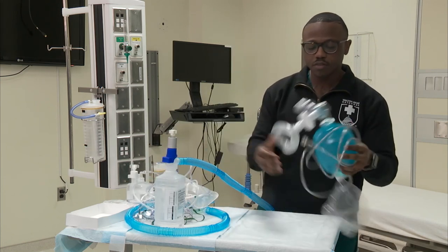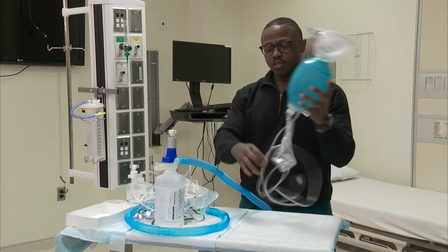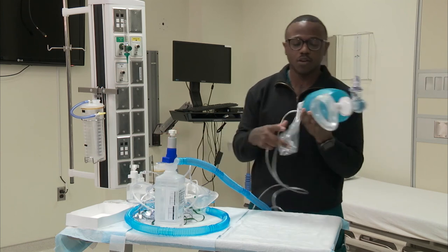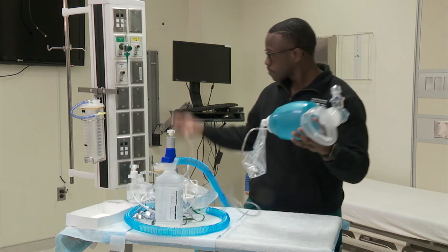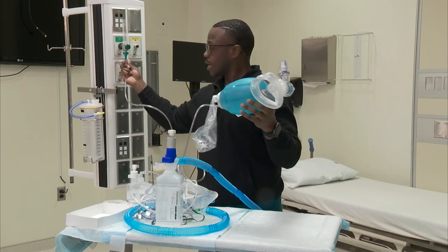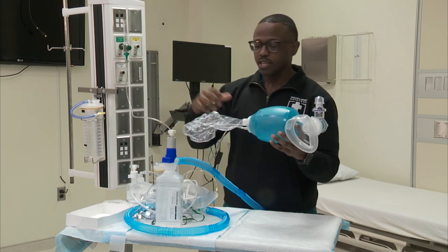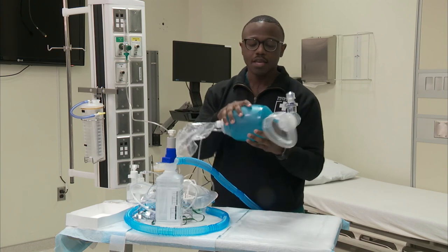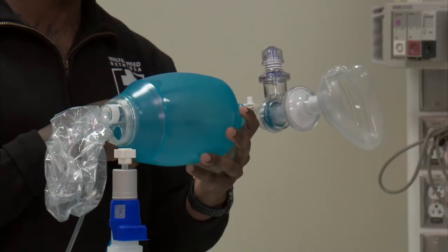Finally, I'm going to cover the Ambu bag. This resuscitator device is a self-inflating bag. You have oxygen tubing that you attach to your flow meter and a reservoir bag so that when you're bagging your patient, you're delivering fresh oxygen directly from that bag. As I depress on this, it's filling up — it's a self-inflating bag.